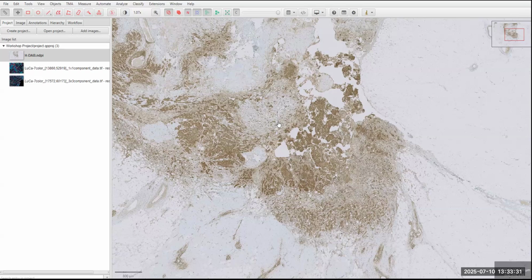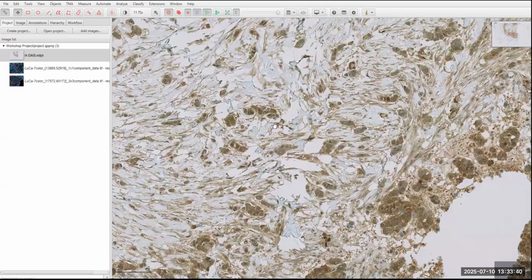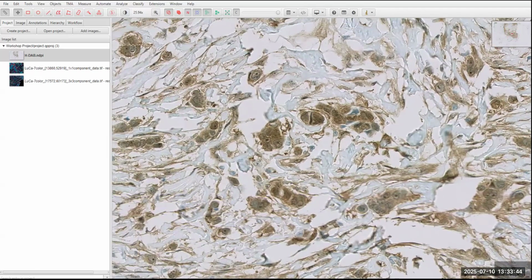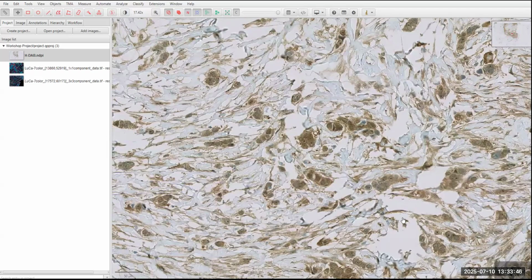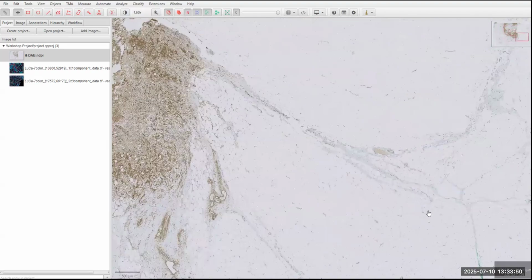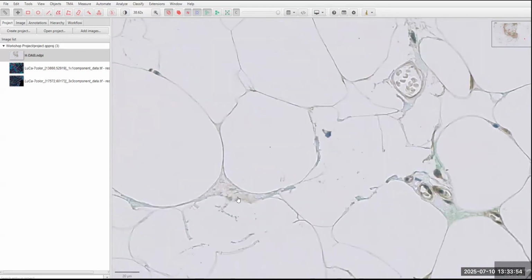What it was actually doing is peeling off the layer above it. So I'm essentially going down through the layers of the pyramid to get to the full resolution of the image. We're not seeing anything else. We're just seeing this one part of it because the actual image itself is massive, but we're just zooming in by peeling off those layers to get to the full resolution.